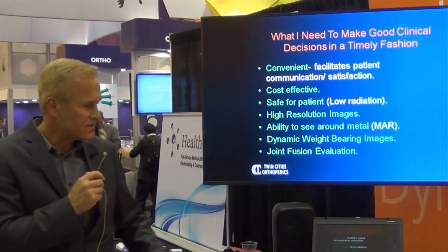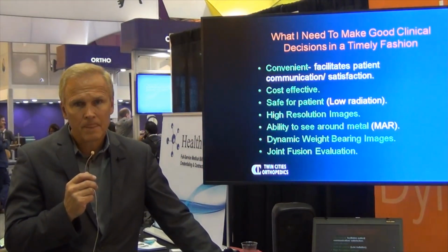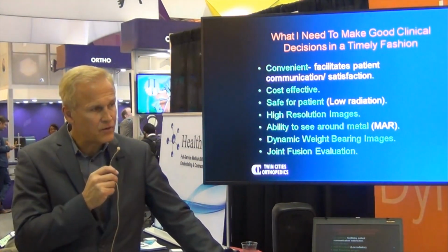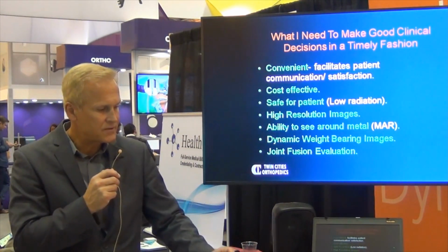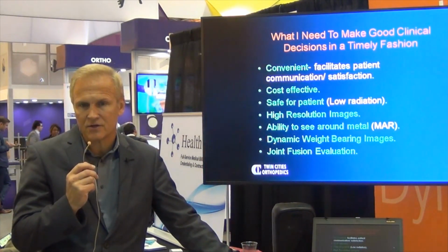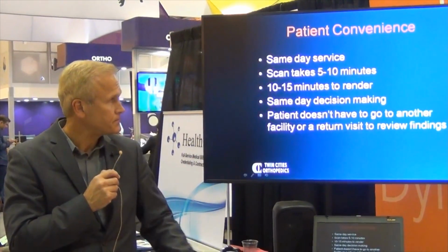And again, I've been using this a lot in my practice for evaluating my fusions, especially my subtalar and midfoot joint fusions and also second, third TMT joint fusions. I get enough detail from these even within 8 to 10 weeks to know whether or not there's been some trabecularization of the bone across the fusion site.